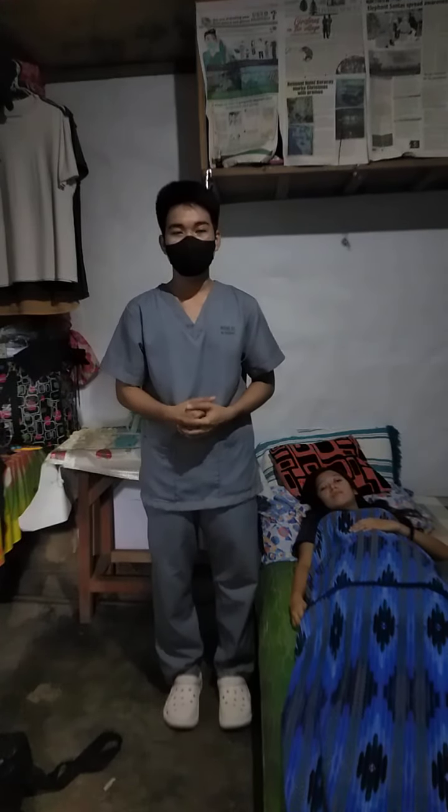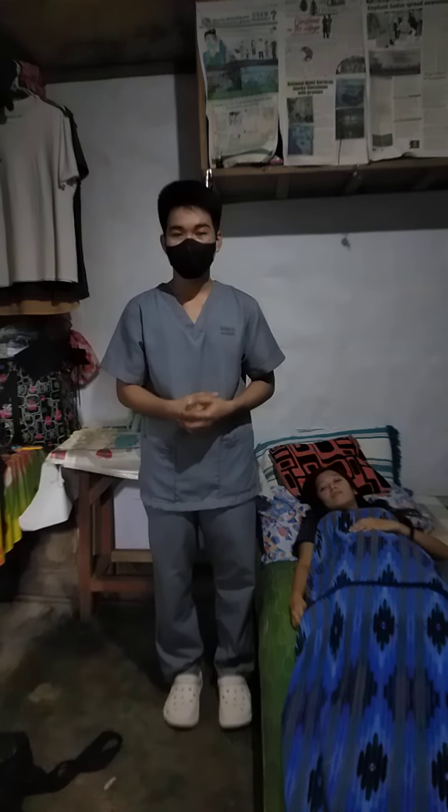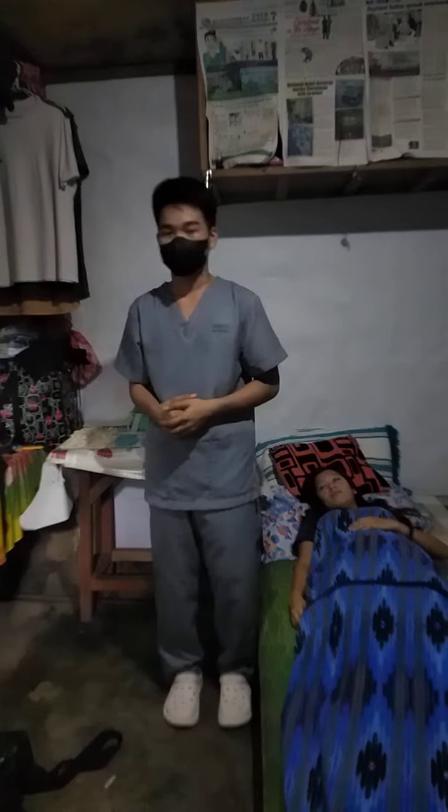Good day, ma'am. I am Surab Buisan, 3BSNA, and I'll be performing the insertion of nasogastric tube. So first is to verify the medical order for insertion of an NG tube to ensure that the patient receives the correct treatment.